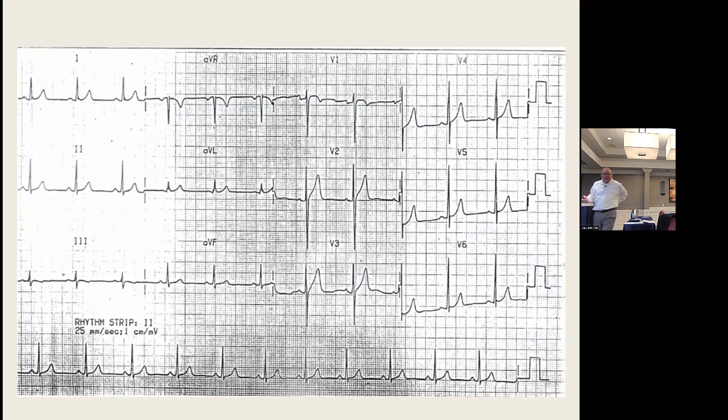So early repolarization abnormality, for those who have taken the family medicine recertification exam, it's uncanny how early repol shows up. I've taken the exam, I don't know, 5 times in my life or something. It's shown up at least 3 times. So this is one worth learning, if not for that, for the fact that it's a common abnormality that we see in young, healthy people.